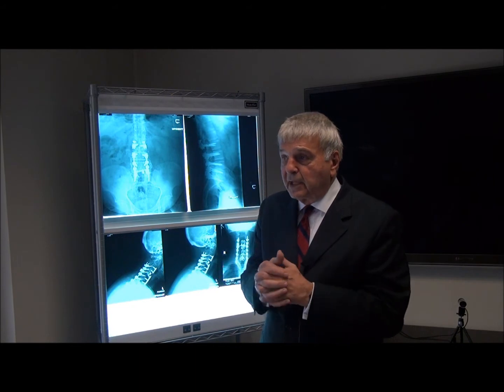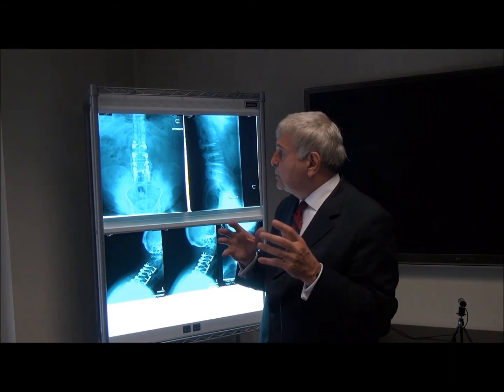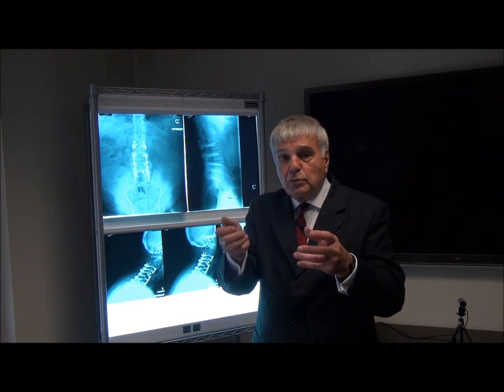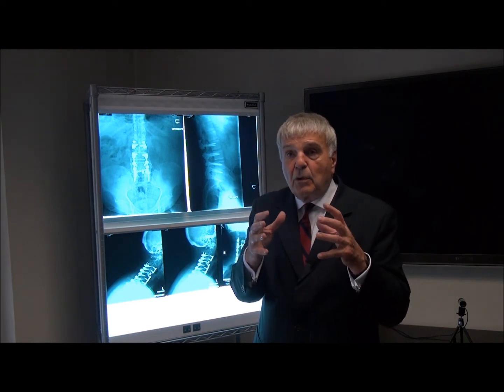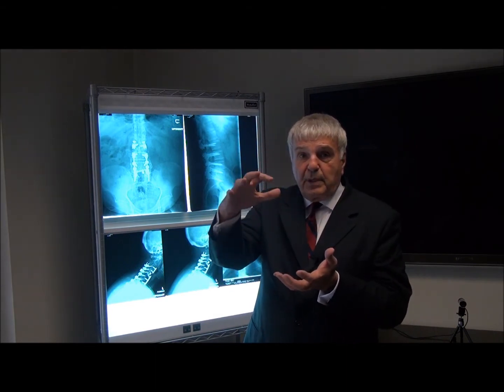Well, one of the things that's employed is to fuse the spine. In other words, you put in hardware that consists of screws and plates, and you join everything together so that the spine becomes one solid piece, so to speak.